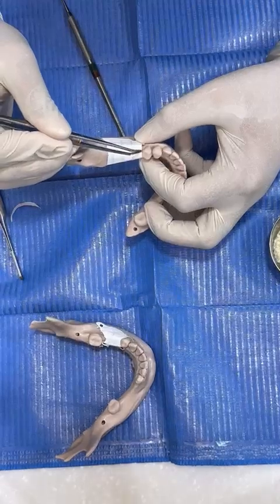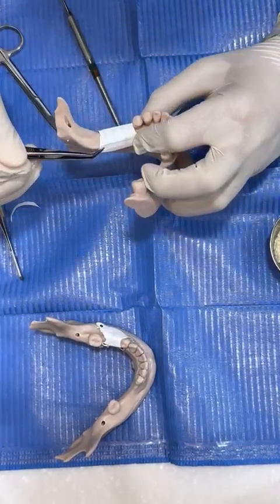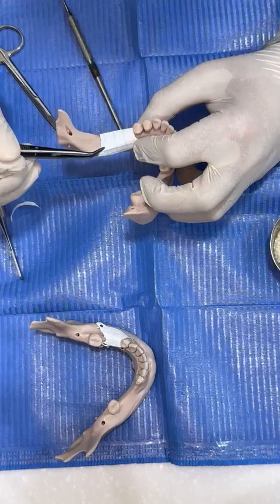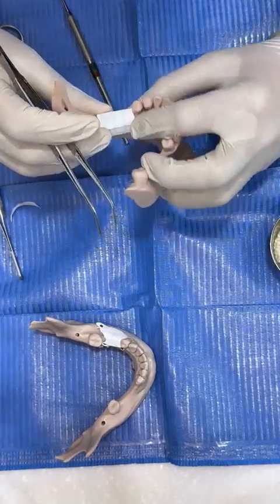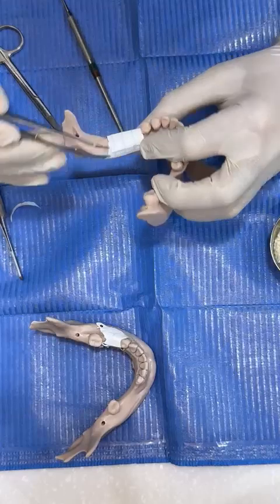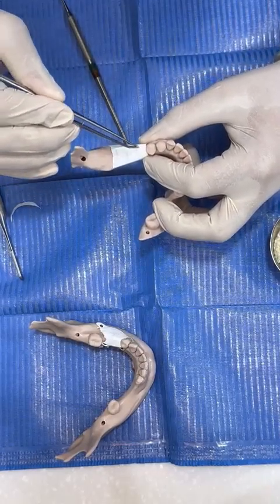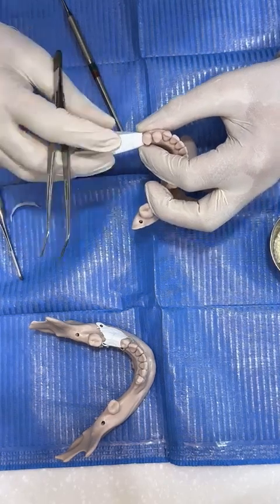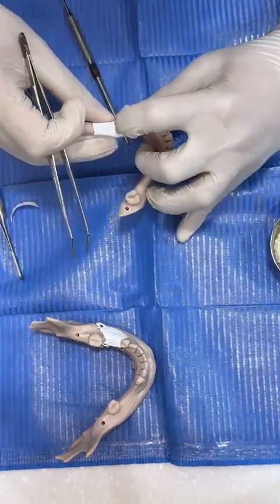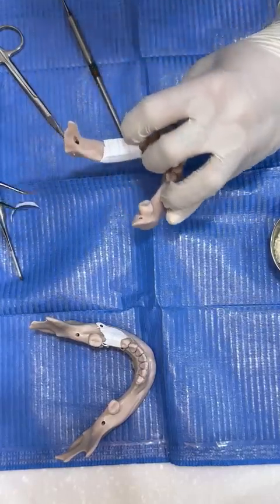You put a temporary pin, then he fixed the lingual, because any rotation of the membrane will make it very hard to reorient it later. So I will ask my assistant, or if you are doing simultaneous implant and bone grafting, or a tenting screw is here, you can put your finger, fix it until we make the first screw. Okay.